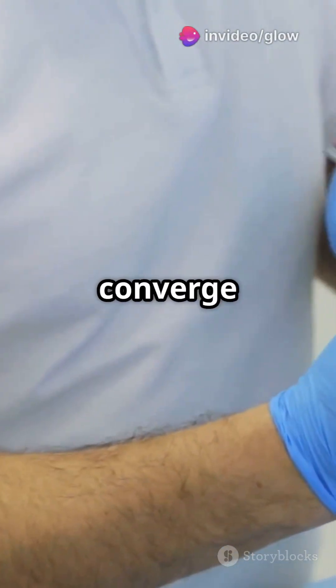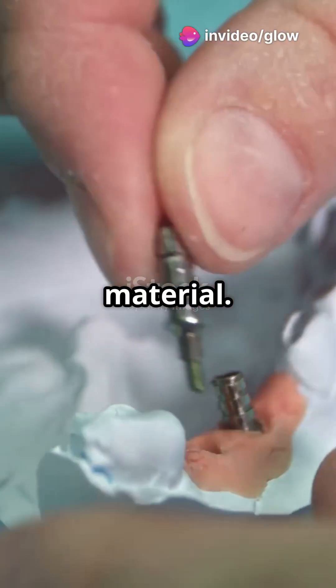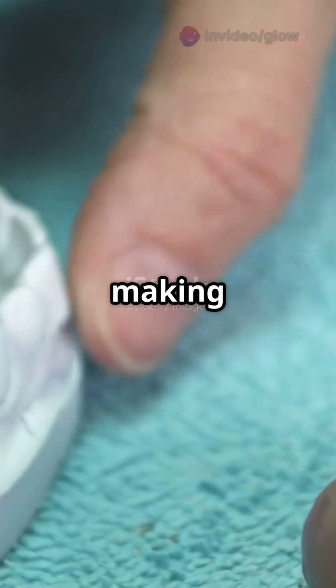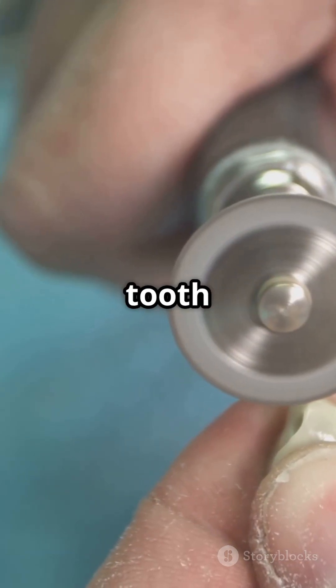For retention form, those walls converge a bit and we might add grooves or locks depending on the restorative material. Convenience form is all about making sure there's enough access for visibility and tools, without unnecessary removal of healthy tooth structure.